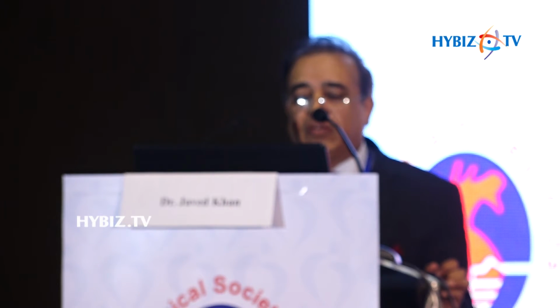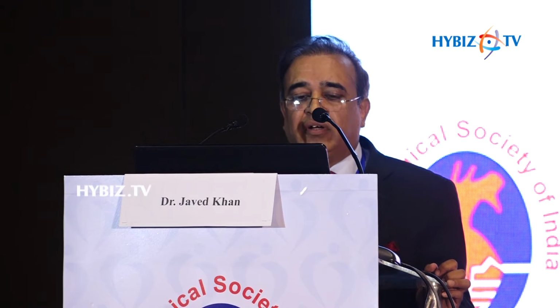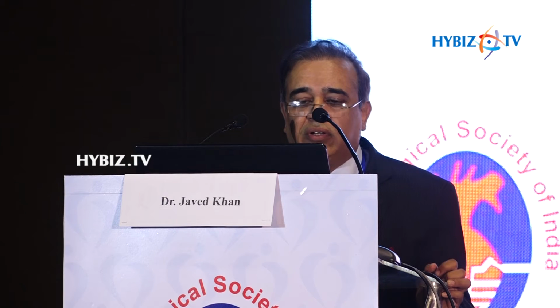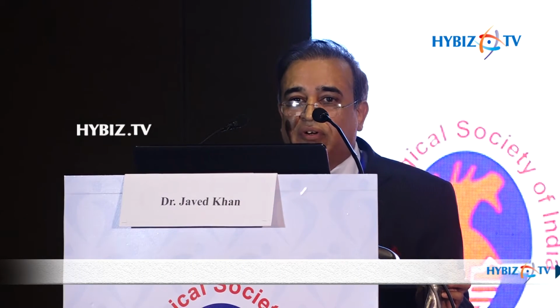Angioplasty as well as stenting was done in the regular manner, and a 13 millimeter stent was put across the lesion. That was the final shot immediately after putting the stent, before shifting the patient to the ICCU. The only thing was the wire.